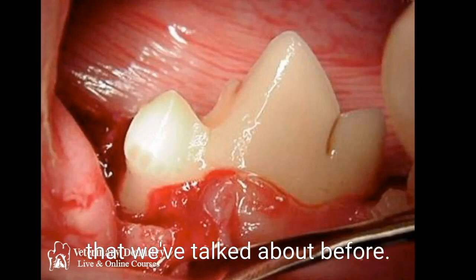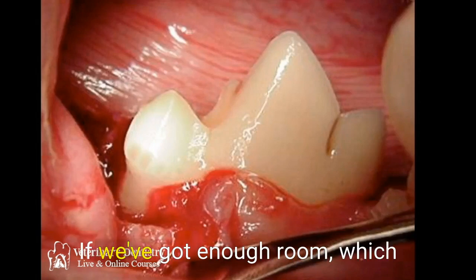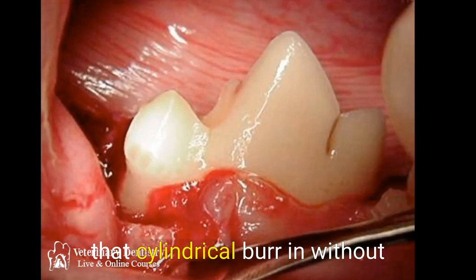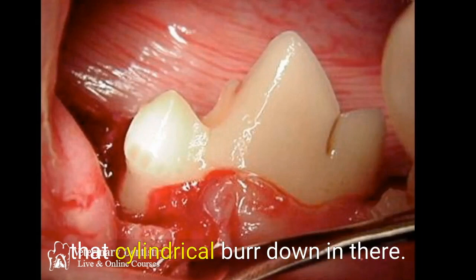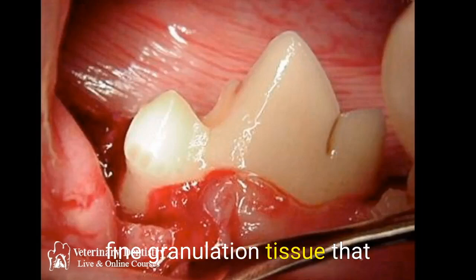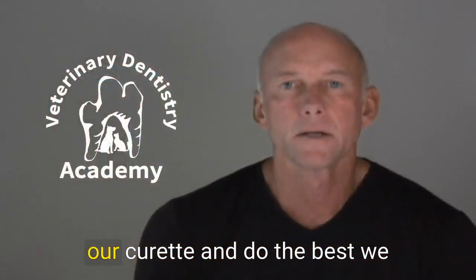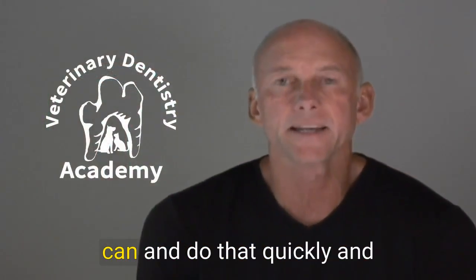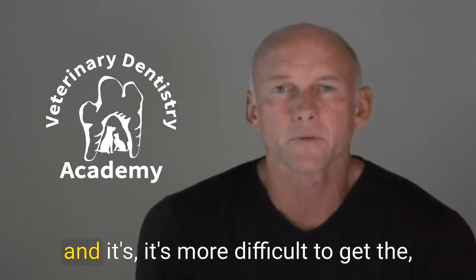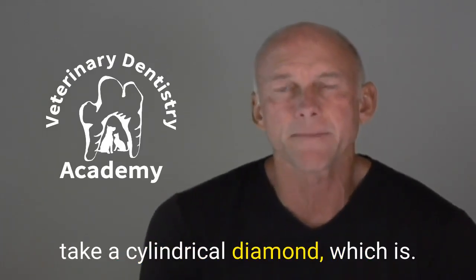Another thing that we use — and I don't think a lot of you realize we've talked about this before — is a fine cylindrical diamond burr. If we've got enough room around that defect, where we can get that cylindrical burr in without damaging the tooth, we'll take it down in there and eliminate the fine granulation tissue that exists after we use our curette. We go down with our curette, do the best we can quickly without worrying too much about hemostasis, and then once it's more difficult to get the little segments out, we'll take that cylindrical diamond.